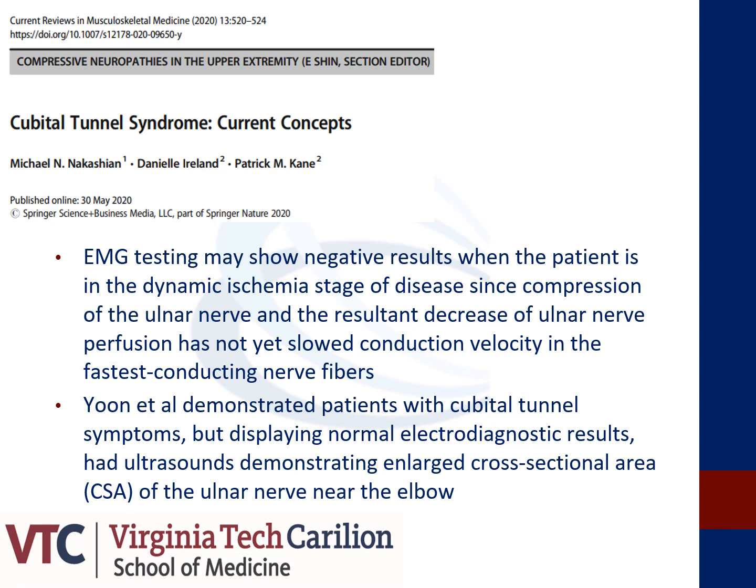In fact, Yoon et al. demonstrated that patients with cubital tunnel symptoms may display normal results, while ultrasound may be able to detect cubital tunnel syndrome prior to electrodiagnostic changes.